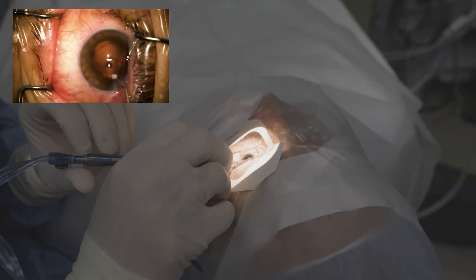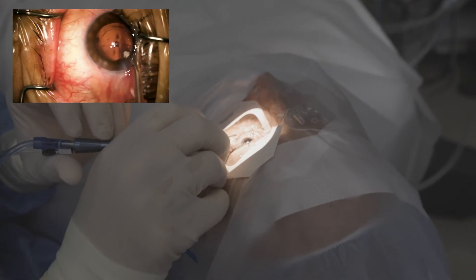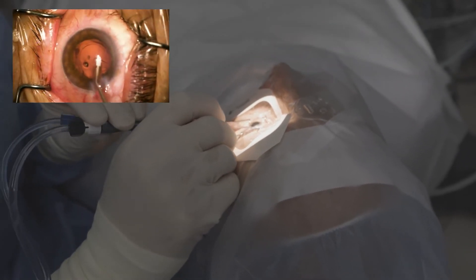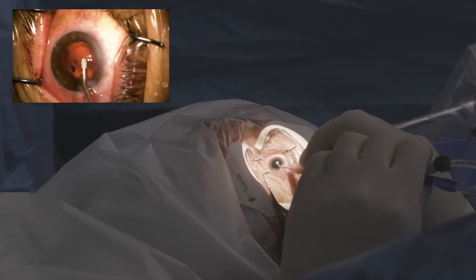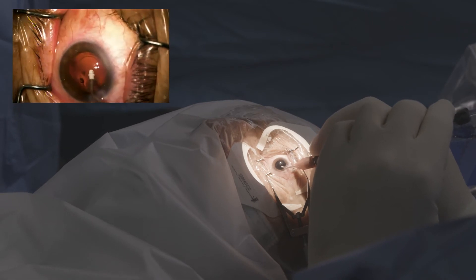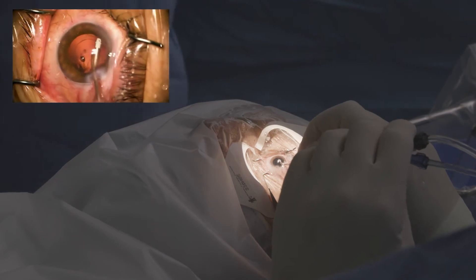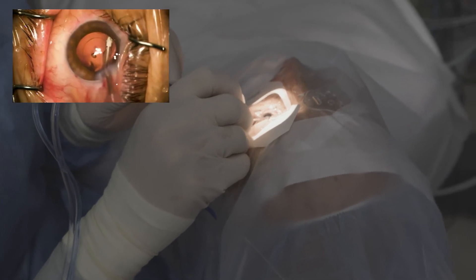So if you feel like you need to see the cortex — watch — you can still have an image. And because in this particular case we may be treating some of the peripheral part of the lens, we just do a little cleanup of the undersurface of the anterior capsulorrhexis peripherally, which once again you can see is very simple to do with an automated capsulotomy. It's very straightforward.